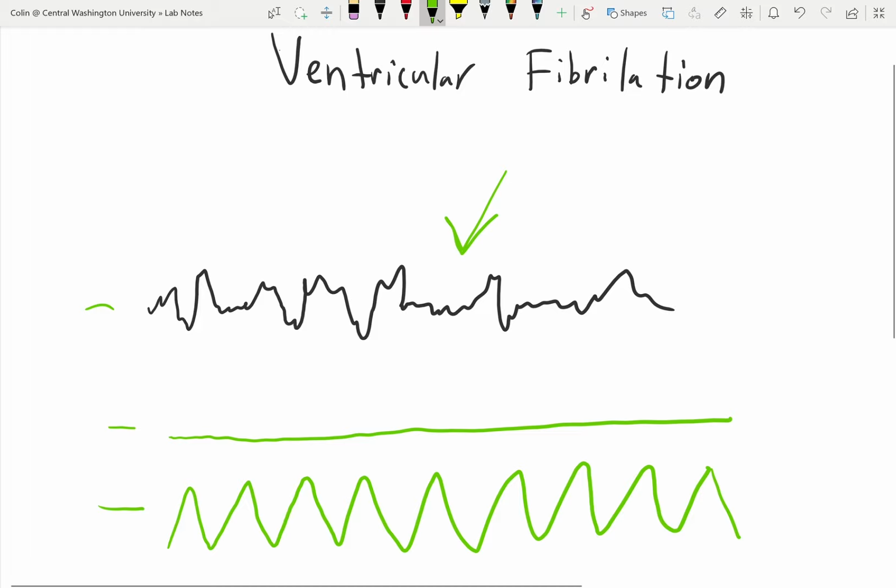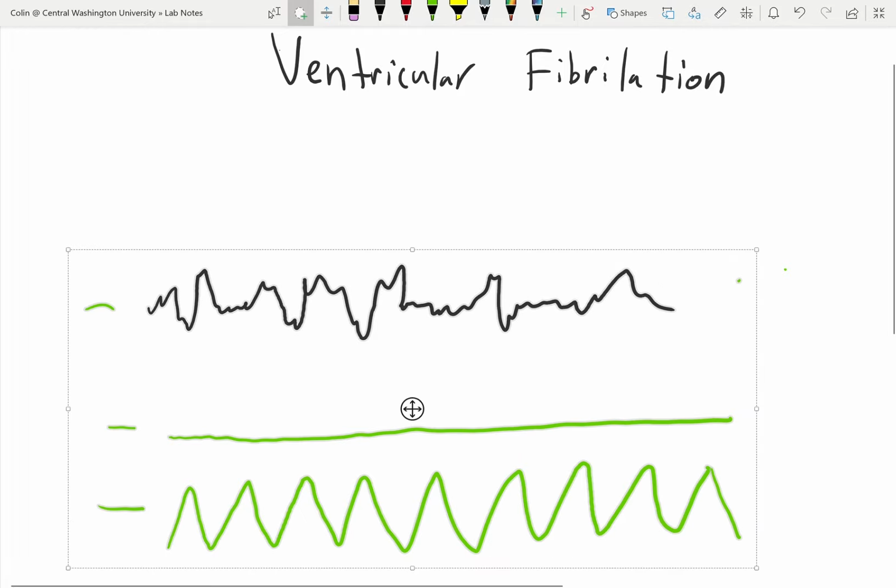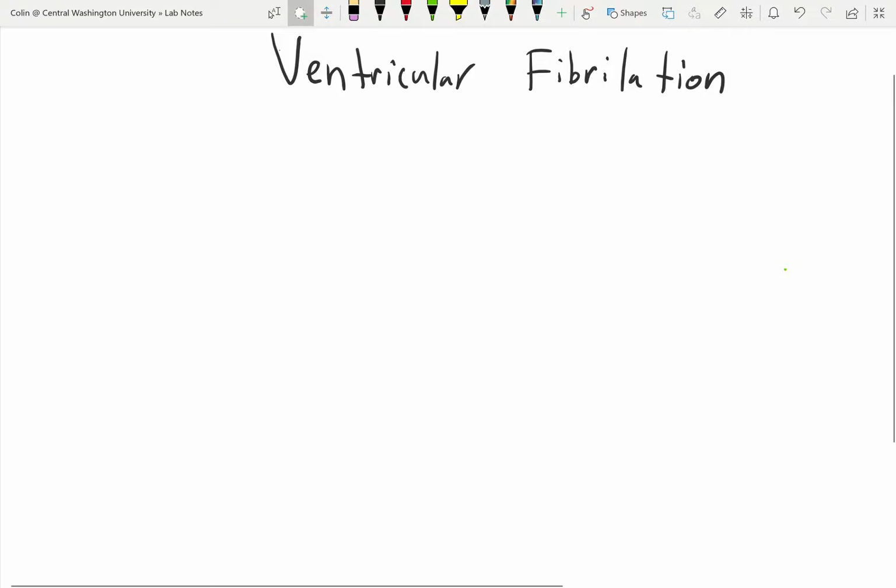And it makes sense because of what's happening electrically in the heart. Like we said, we'll draw the heart here. There's just points all around here saying beep, beep, beep, beep, and so it's fibrillating. While we're at it, let's go over Vtach because we've got it written down here. So let me erase all this, and then we'll talk about that because those are the two shockable rhythms. If anyone ever asks you what are the two shockable rhythms, it's Vtach and VFib.